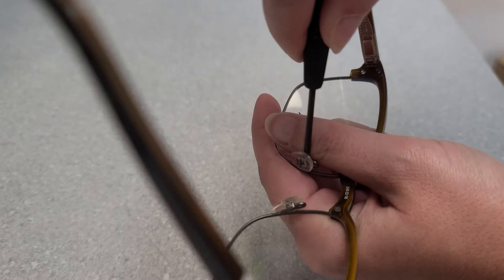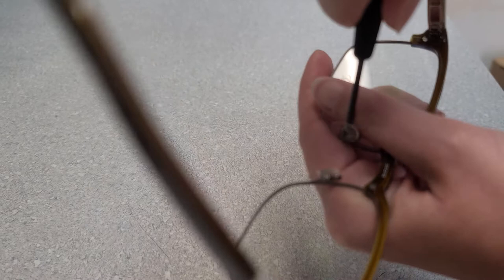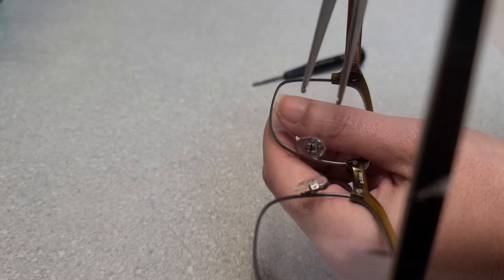Then using a screwdriver, either a flathead or a Phillips, whichever the screw that is in there needs, go ahead and loosen. It's always nice to use the screwdriver against your thumb to help steady yourself. You can use either your fingers or nails to pull the screw out, or tweezers. I personally prefer tweezers since I have kind of long nails, and sometimes the stuff around nose pads is kind of gross.